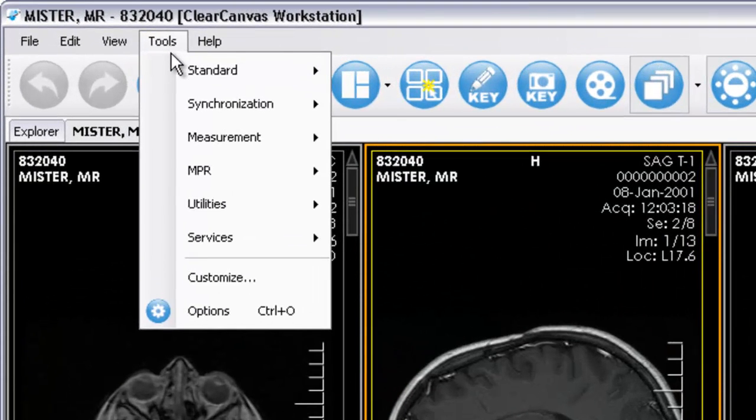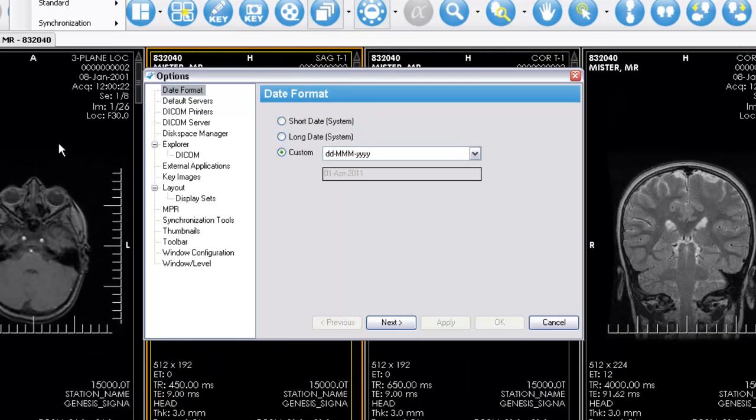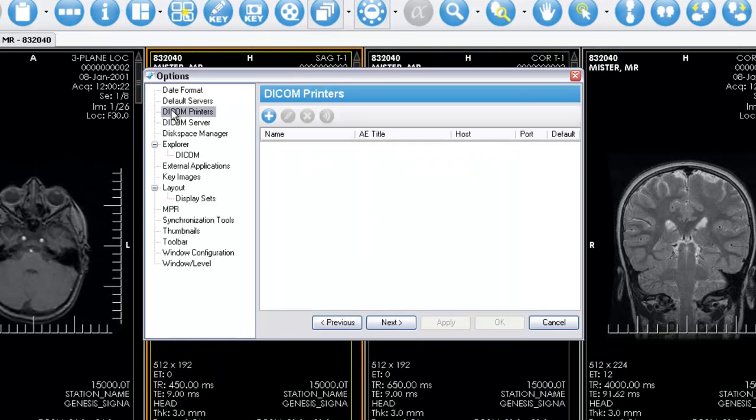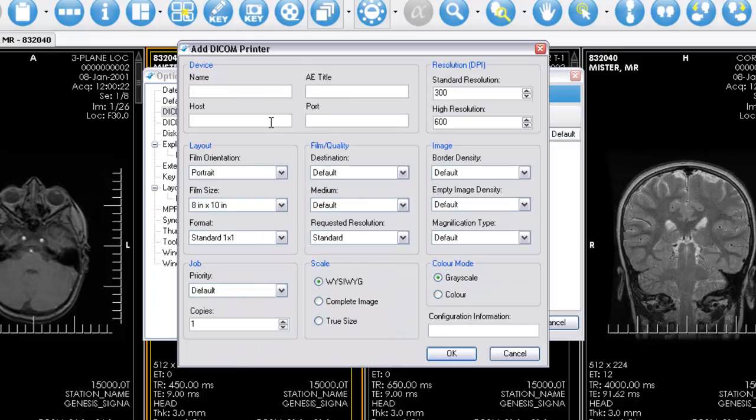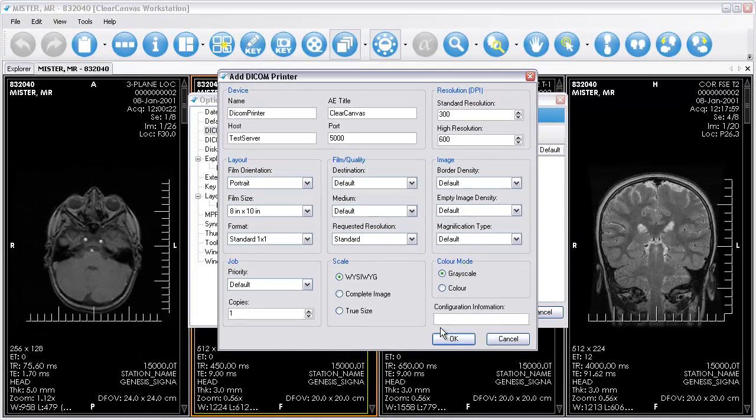go to Tools, Options, Dicom Printers. Click the Add button and provide a name, AE title, hostname, and port. You can also configure other printing options here, which will be used by default when printing.